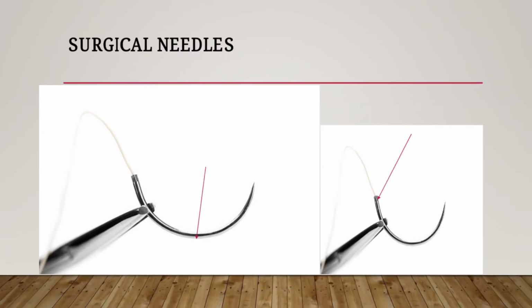Surgical needles. These are important, that is surgical needles, which are used for suturing purposes in surgery. Anatomically, surgical needles consist of the eye, where we knot the suture material, silk or chromic catgut. Sometimes they are swaged or sometimes they are not swaged. Another part is the body, which is an elongated tube, and the third one is the point, which is the tip.